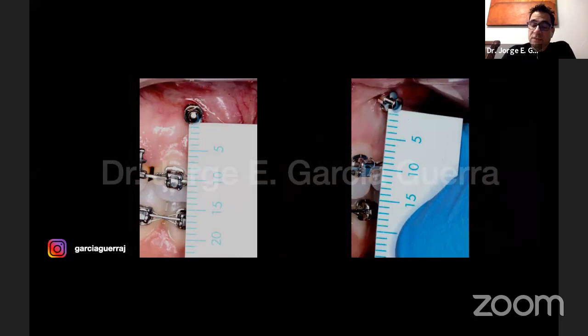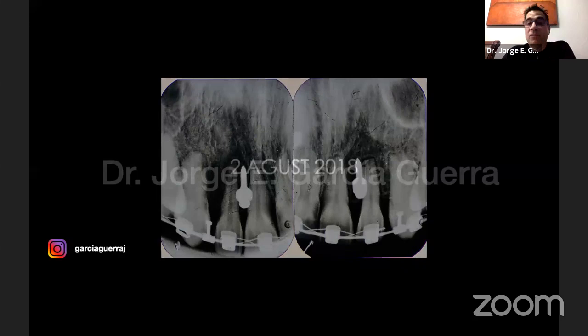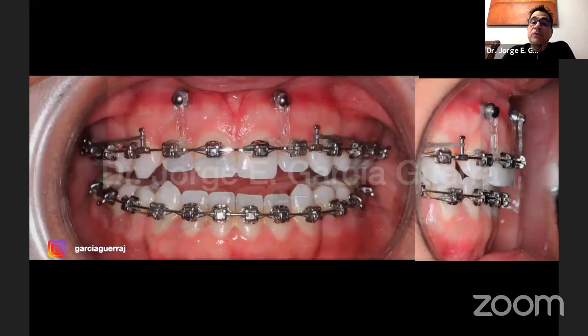It's very important to take an x-ray. And we saw here, you can see the resorption on the lateral incisor, even though we're using self-ligating brackets. So that happens in any kind of treatment. This is a little bit more in the treatment. So we're correcting the overjet, the overbite. We open a little bit more of the bite here, but we're working on this so we can start closing the spaces.